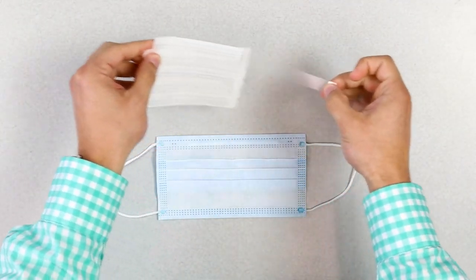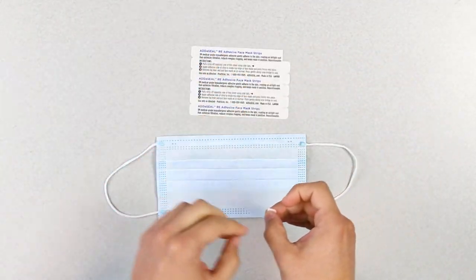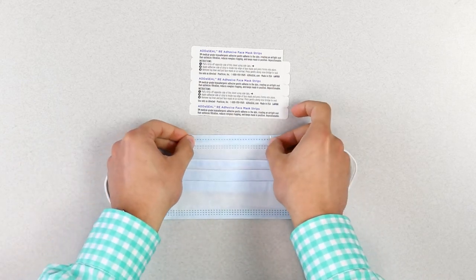Made with a 3M medical-grade hypoallergenic adhesive, Add-A-Seal works with any face mask to improve fit and performance.